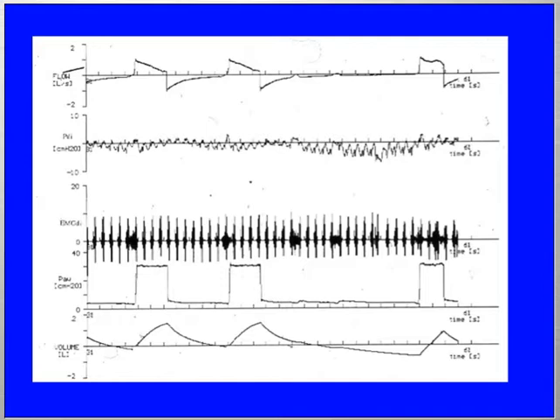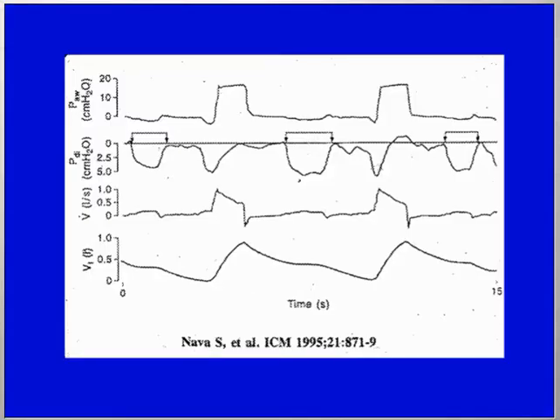And this may be very frequently a cause of sleep disruption in the ICU. The other problem, you see the small efforts, the other problems, which I will not describe in detail, but again well known, are ineffective efforts, where the patient is hyperinflated by the breath and try to trigger the ventilator without success.